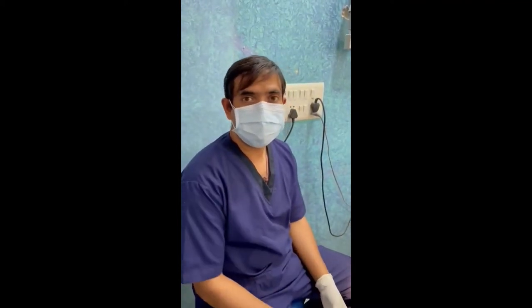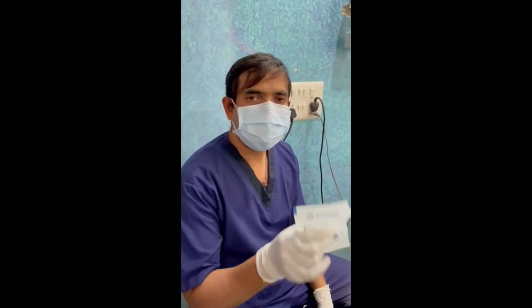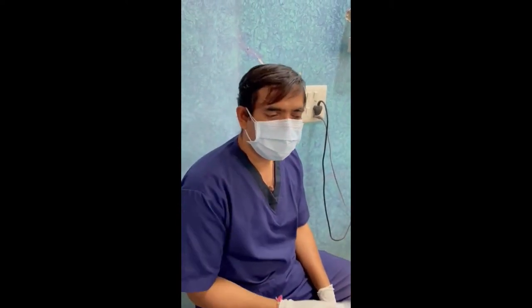Hi friends, today we have a special patient here in America for Invisalign treatment. We can trace this Invisalign treatment in America.